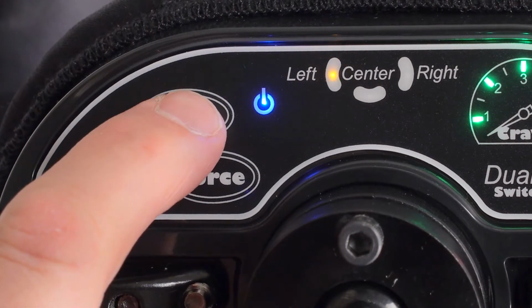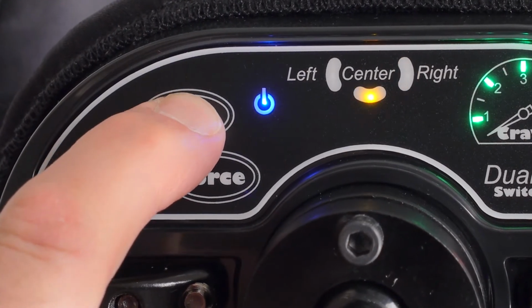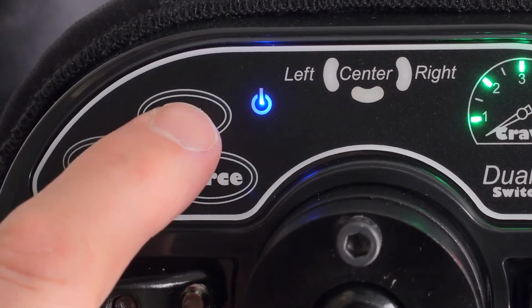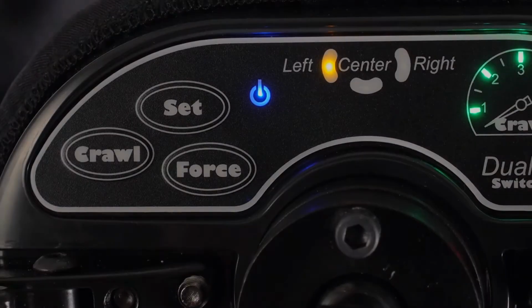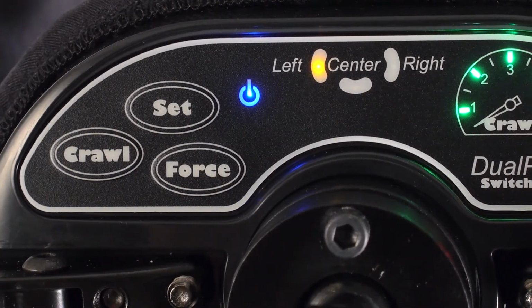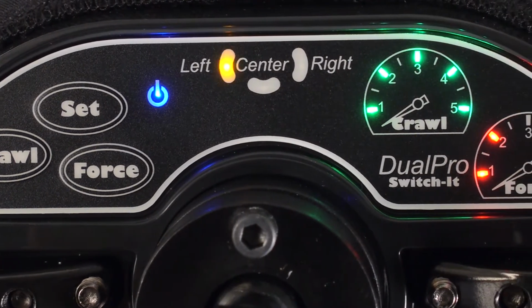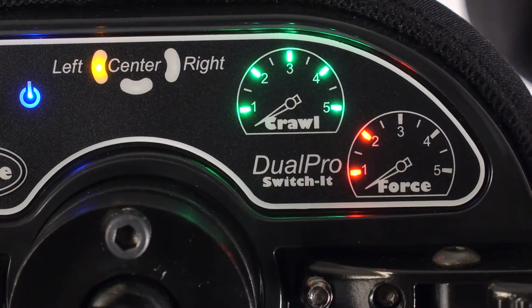If Set is pressed again, the right pad starts flashing and is now programmable. Hitting Set a third time moves the programming functionality to the back pad, and a fourth hit returns the headrest to normal operating mode. In programming mode, a series of green lights may or may not appear in the crawl indicator, and red lights may or may not appear in the force indicator.